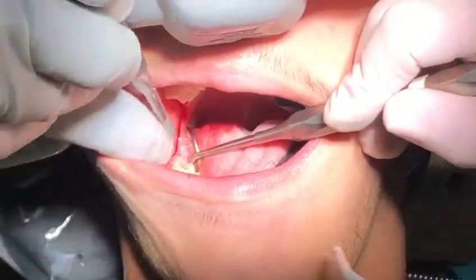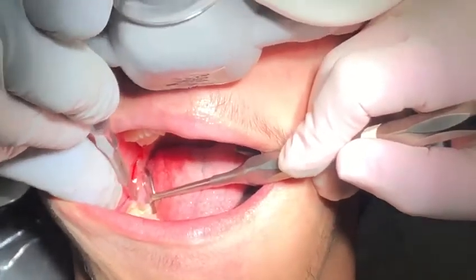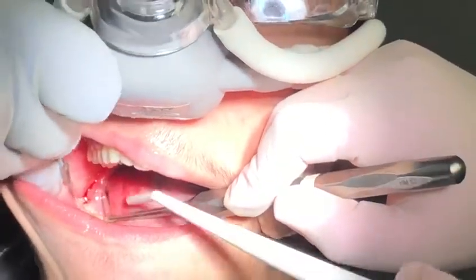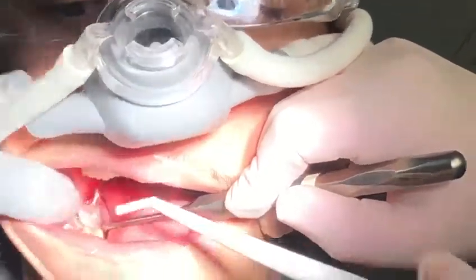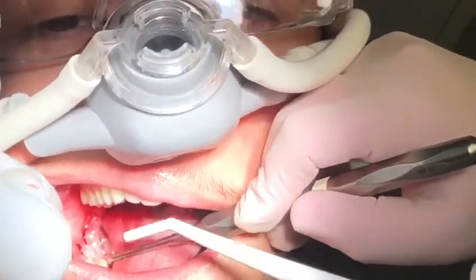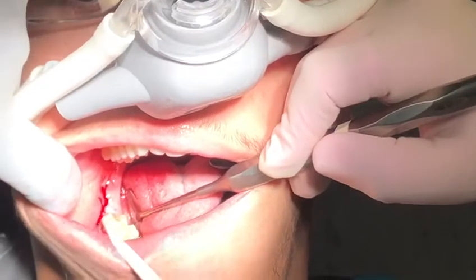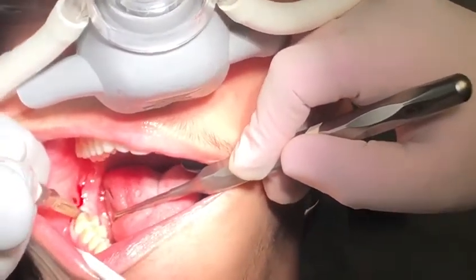First, second, third molar — right there somewhere. A couple of nice deep breaths through the nose, very good. You're going to feel pressure — pressure again. A lot of times if you're not doing anything you can do this. Maybe make it a little bit better. Pressure, pressure, pressure. Good job.